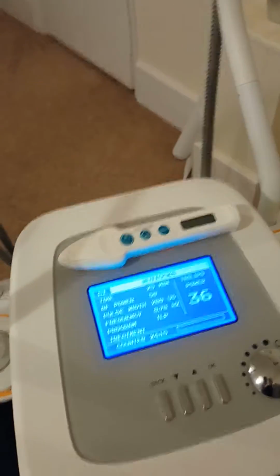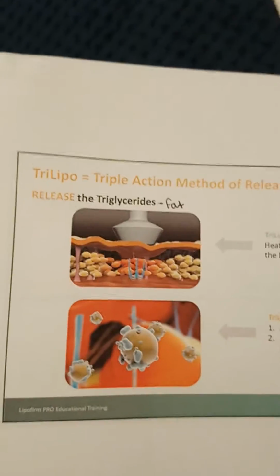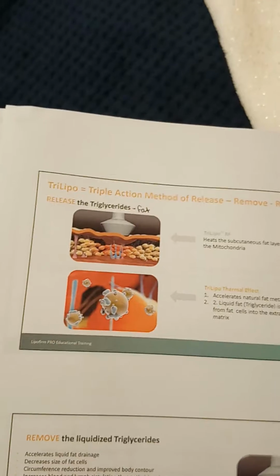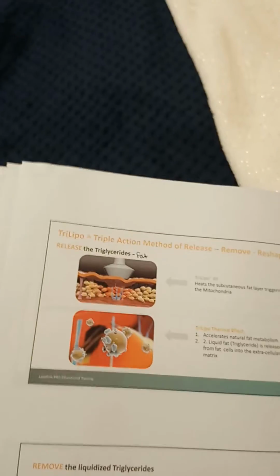So what we're going to be doing is tightening up that skin by heating up with the radio frequency right down into your collagen and elastin fibres, as you'll see here. And what we're going to be doing is creating a reaction down there in the dermal layer, and we will be stimulating those collagen and elastin fibres. They're all going to be jiggling around and thinking, oh gosh, what's happening? That is what causes the tightening of the skin to come back together again.